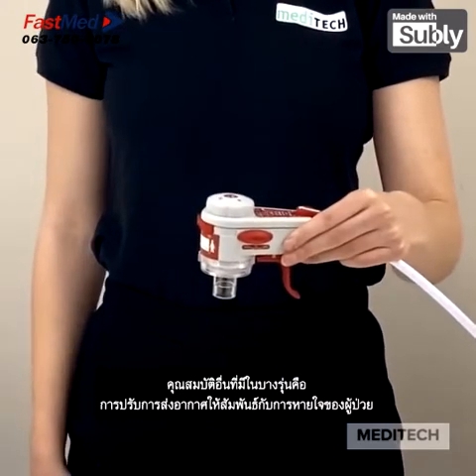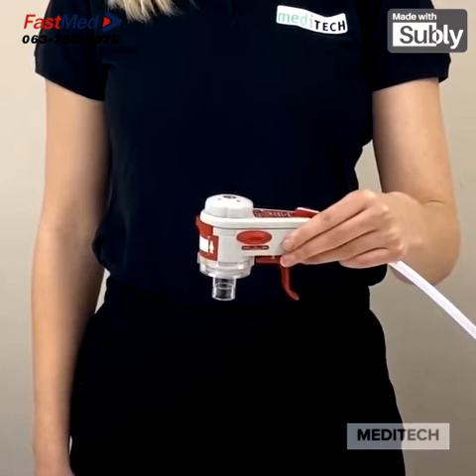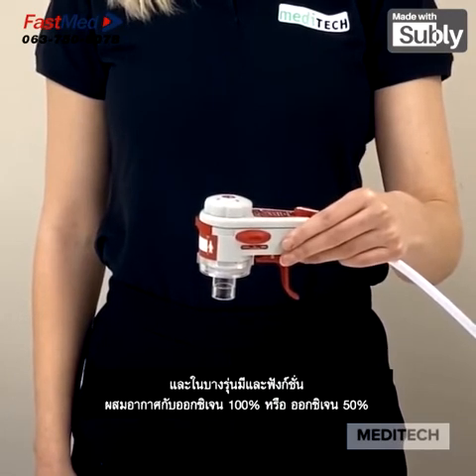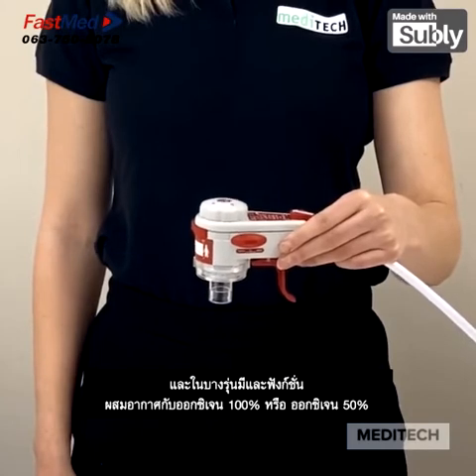Another feature available with some models is patient assist for synchronised patient breathing. And finally, some models offer an air mix function for 100% or 50% oxygen.